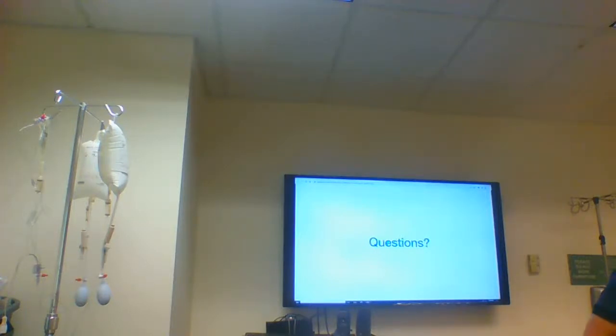And yeah, that's what the order says. The goal here is to, como dice Jose, transfer that care to the bedside nurse. But before they do that, the bedside nurse has to be competent, so we have orders for. So what happened is you got orders post-op for a femoral cath, and in writing it said, cath lab will remove it, right? So that's where the flaw is.